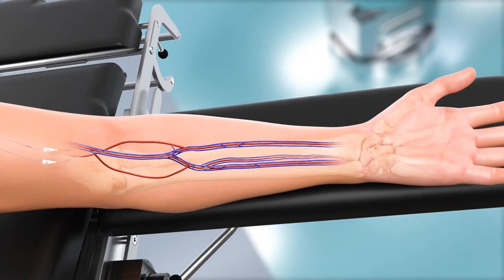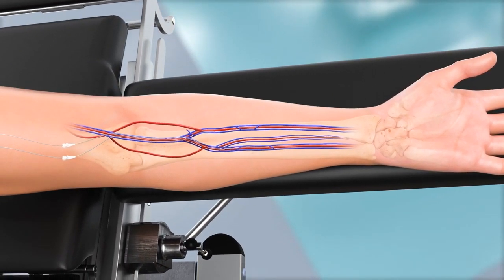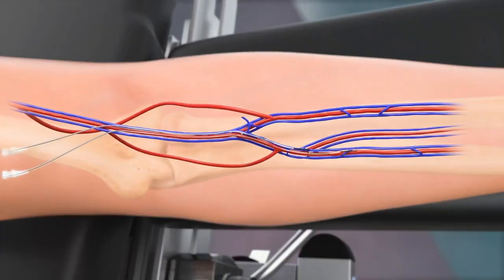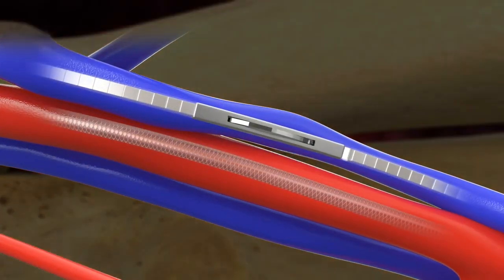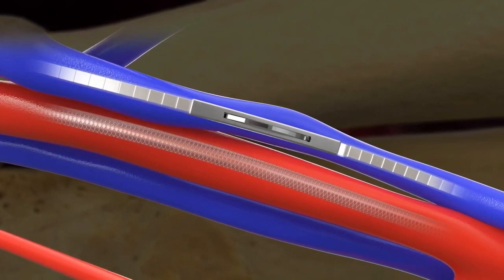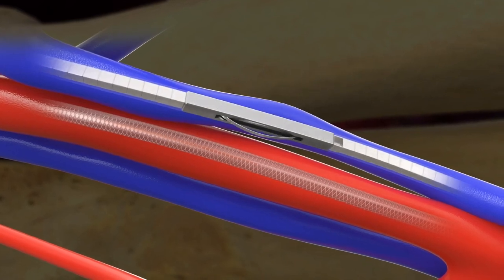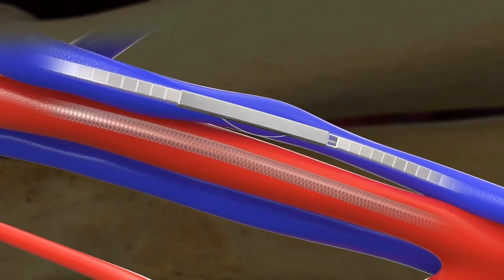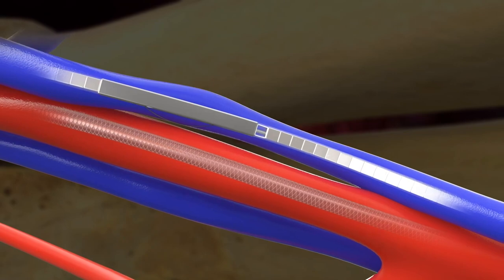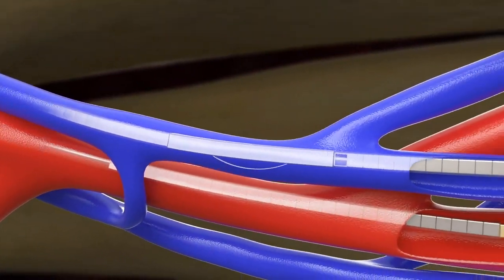Next, advance the venous catheter over the guide wire and through the venous sheath into the brachial vein. Under fluoroscopic guidance, advance the venous catheter toward the target EndoAVF creation site. Before the magnets engage with the arterial catheter, rotate the venous catheter until the illumination of the rotational indicators appear as open boxes, and the arc of the electrode is pointed toward the arterial catheter.